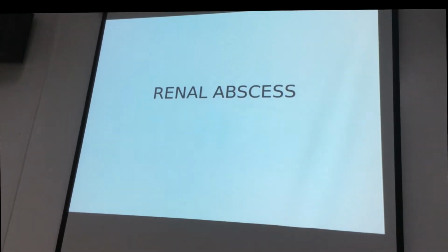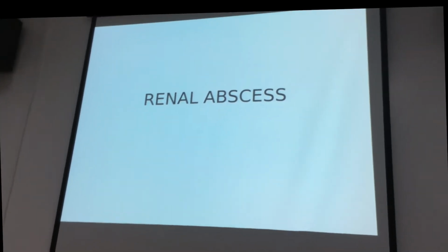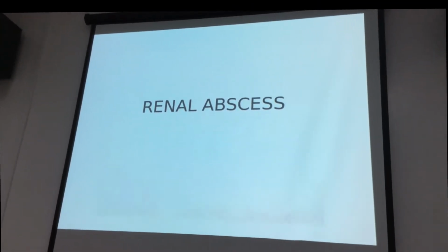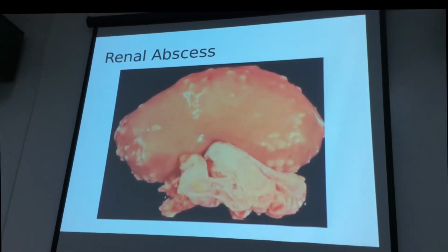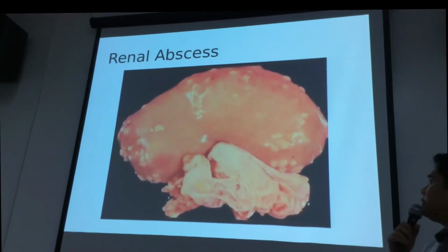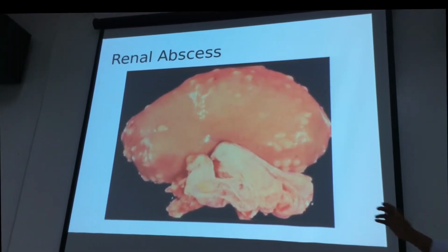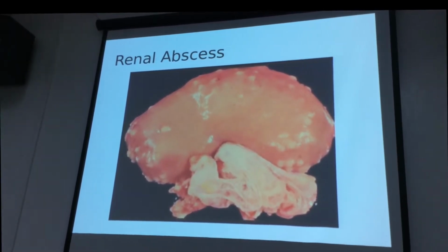Abscess formation, it doesn't matter what organ is involved, whether it involves subcutaneous tissues or solid organs, they all present with the same morphologic features. Now, those pearly white structures that are seen in the cortex of the kidney, there are plenty of them, are your microabscesses.